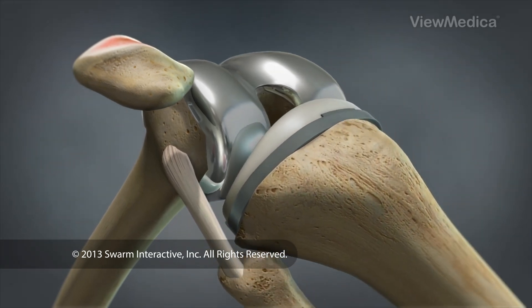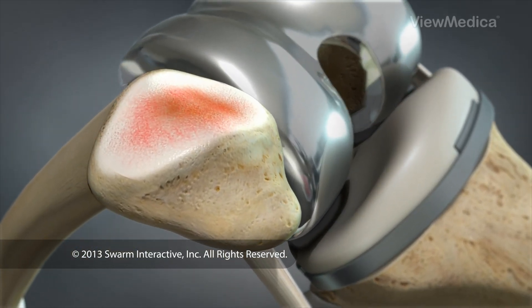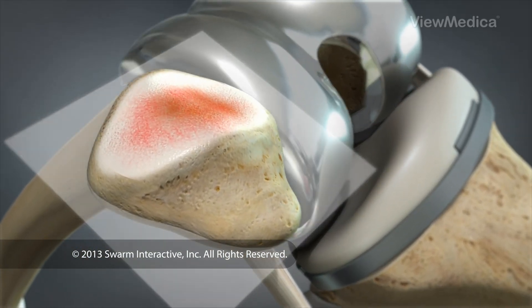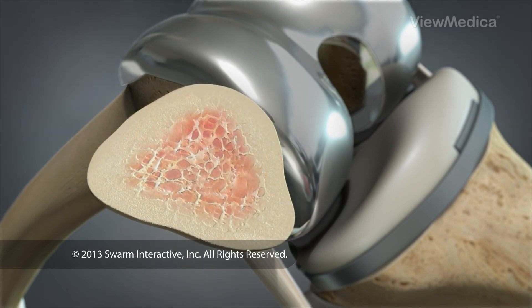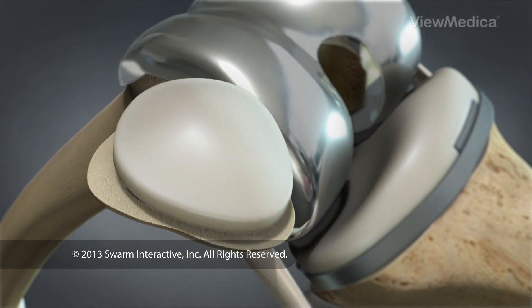In addition to repairing the femur and tibia, the surgeon may also choose to resurface the kneecap. If so, the surgeon will carefully trim away the back of the kneecap and replace it with a small plastic cap.